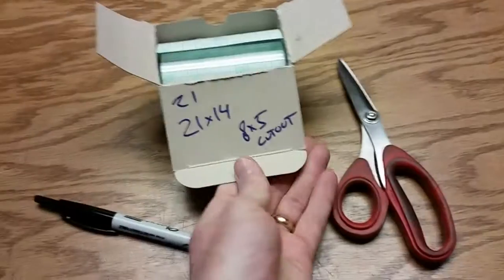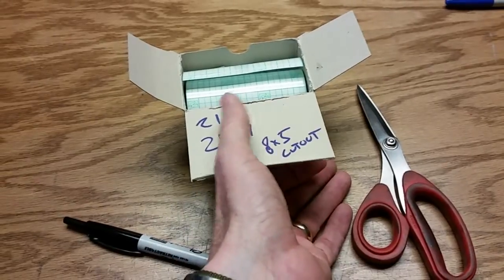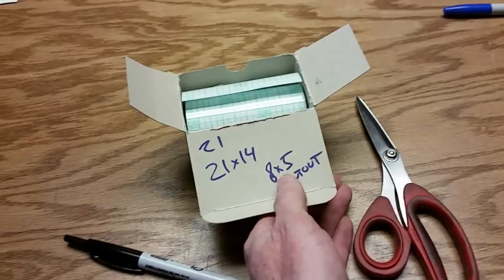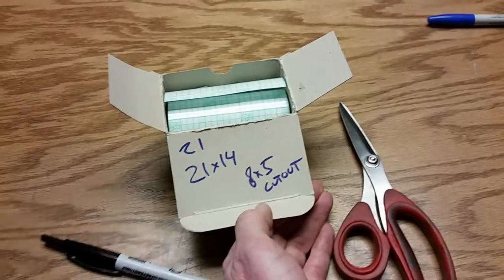You'll notice here on my box I've marked out how I do the cutouts. So you cut off a piece that's 21 squares by 14 squares. There's squares on the tape. And then we cut a center piece out of it that's 8 squares by 5 squares. I'm going to speed through that and get back to the point where the interesting stuff happens.